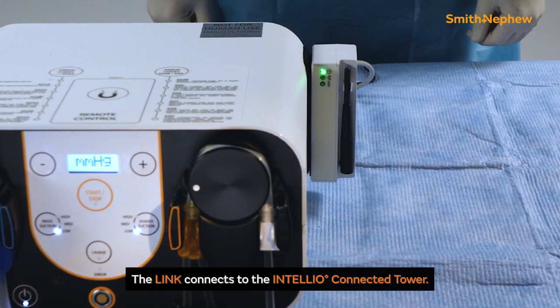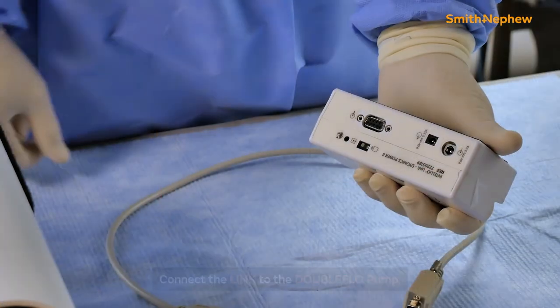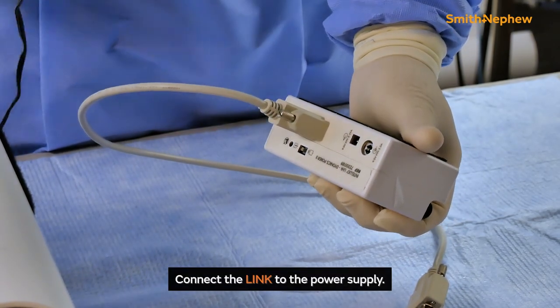To connect the DoubleFlow pump to the Intelio connected tower, the LINK is used. First, connect the LINK device to the DoubleFlow pump with the DB9 cable. Then connect the LINK device to the power supply.